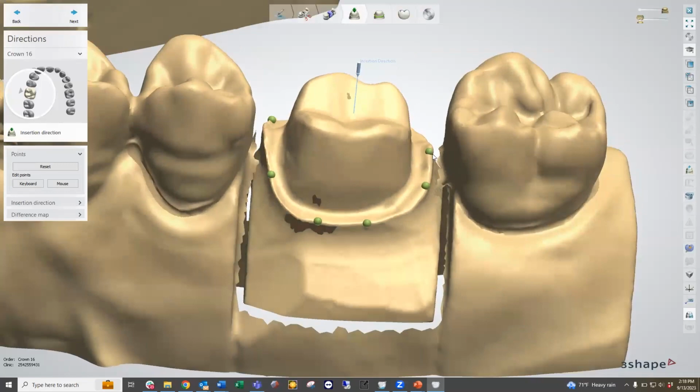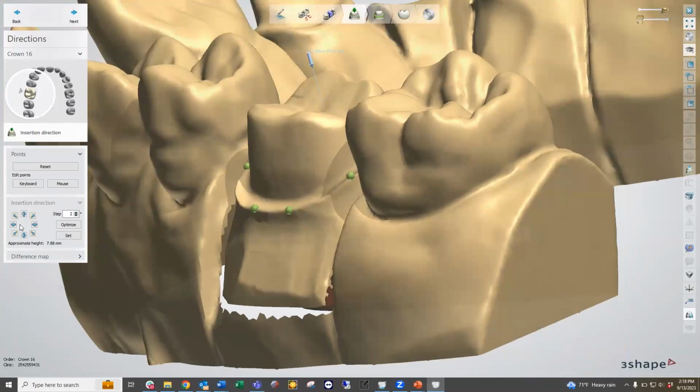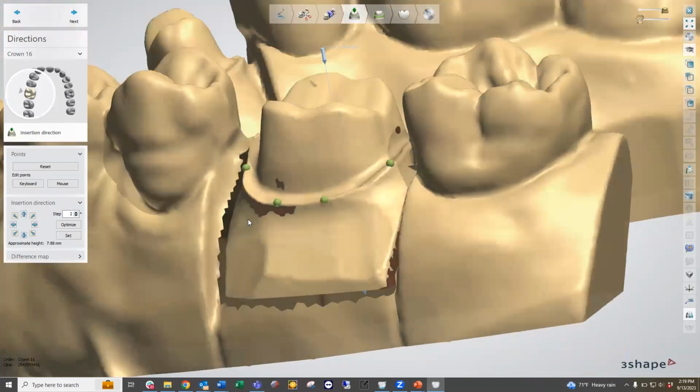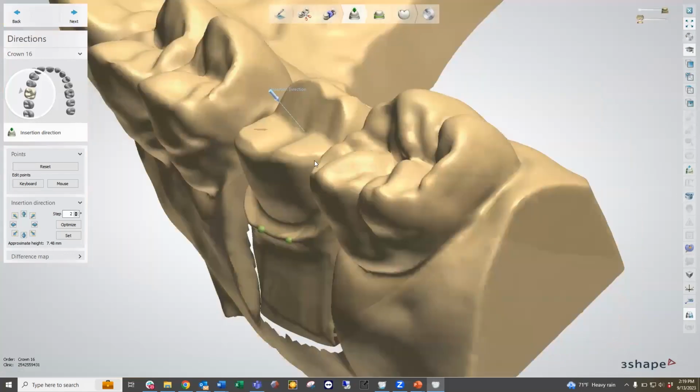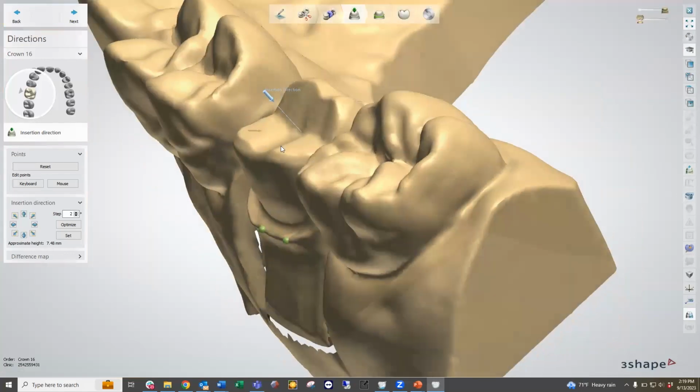But if you didn't want to tackle those green dots, which a lot of people don't want to do, we do have another sub-step underneath here, which allows us to change that insertion path based upon these arrows. These arrows move in a specific direction relative to your view. If I look at the bottom arrow, right now it's going to move a little bit more buccally, but it's going to rotate along a little arc. So I just brought the insertion path more across the buccal.